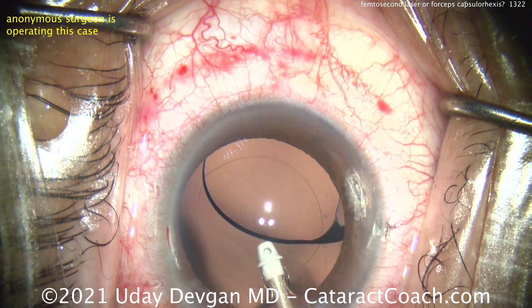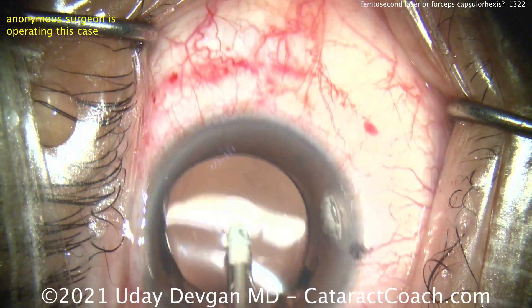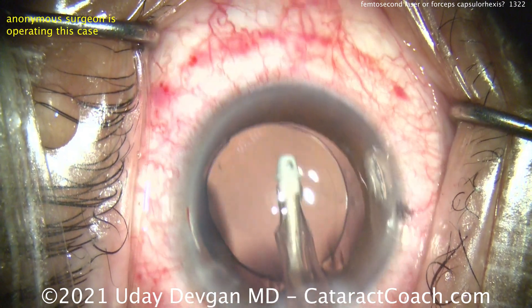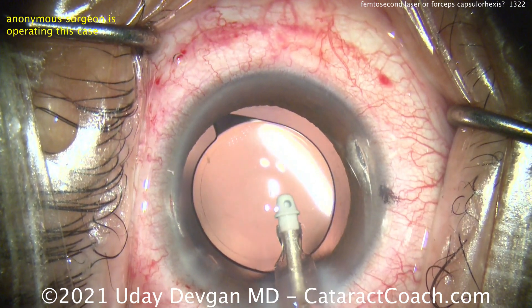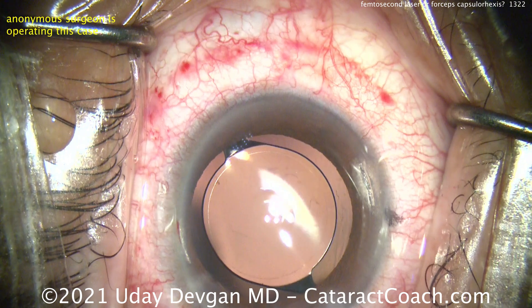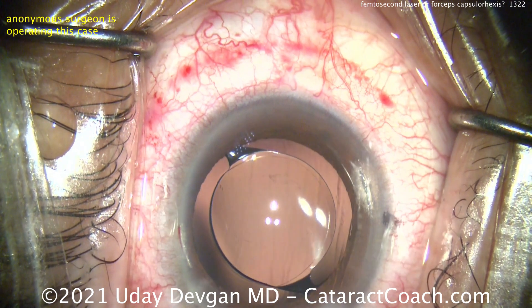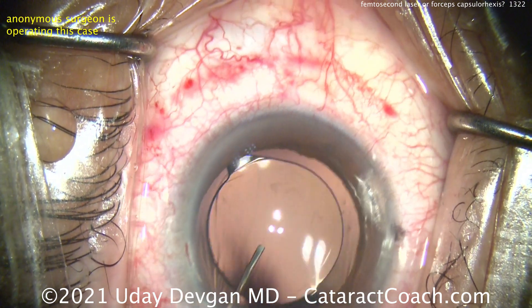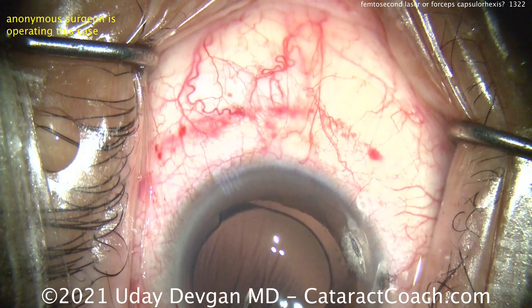We've got to be honest — there's really not a humongous difference here. A femtosecond laser can make it more reproducible or consistent, especially among surgeons with less experience. But for novice or younger surgeons with less than a few thousand cases, don't get too reliant on the femtosecond laser for every case. You need to develop the skills in your hands to use forceps to create a beautiful capsulorrhexis. In most cases, you can have a beautiful result — probably even better in terms of strength and stability with the capsulorrhexis forceps.